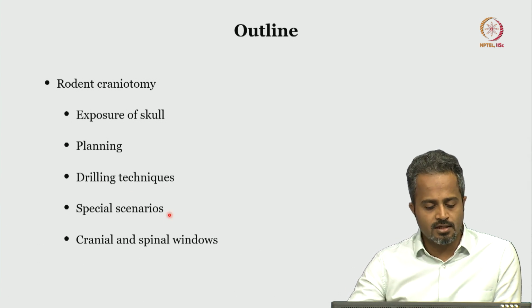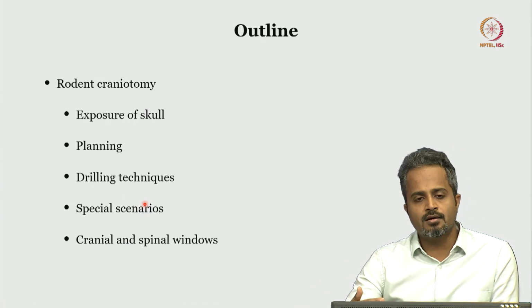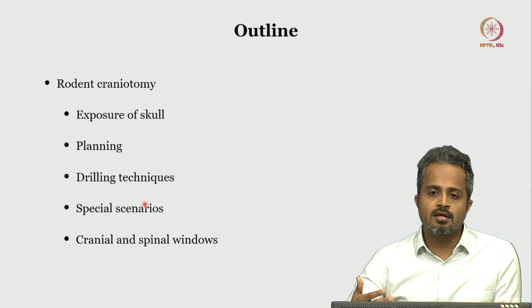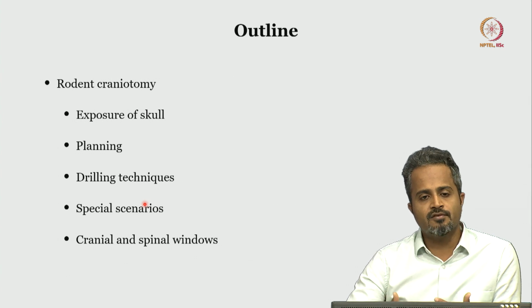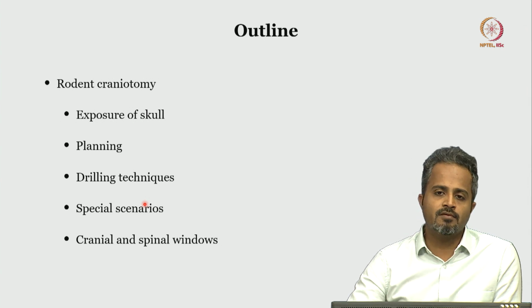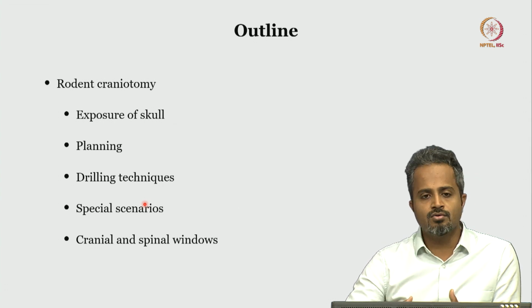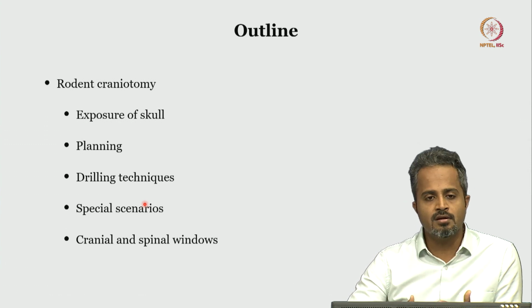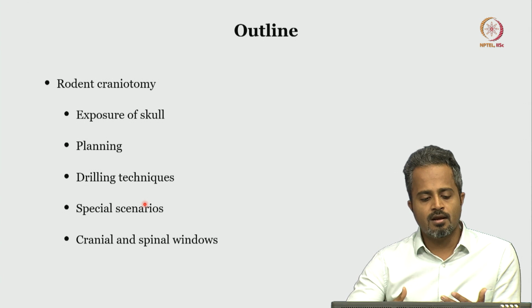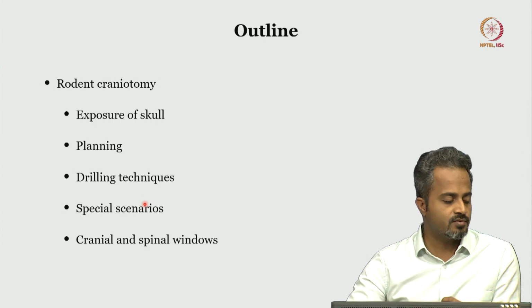And then I'll try and cover the special scenario where the steps differ from the usual craniotomy steps. That is the temporal craniotomy, and the anatomy is a bit different, the positioning is different. There are a lot of things which are different from the usual craniotomies. Then I touch upon the cranial and spinal windows, which is actually the craniotomy itself, but then you don't really make a huge craniotomy, and the application is a little different from the regular craniotomy. So I thought I'll have a brief introduction of these cranial and spinal window techniques as well.